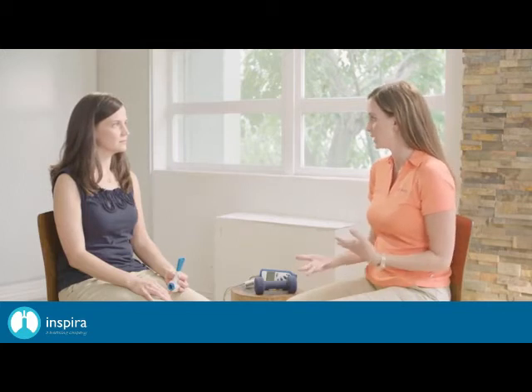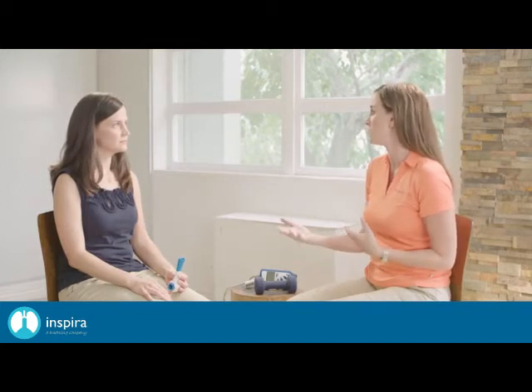Now, on to teaching your patient how to properly use the Breather. Before you begin teaching your patient, introduce the Breather to them with explanations of respiratory muscle training. Demonstrate proper use with your own Breather first. Today we're going to get started on respiratory muscle training. It's similar to exercises that you may have done at the gym.